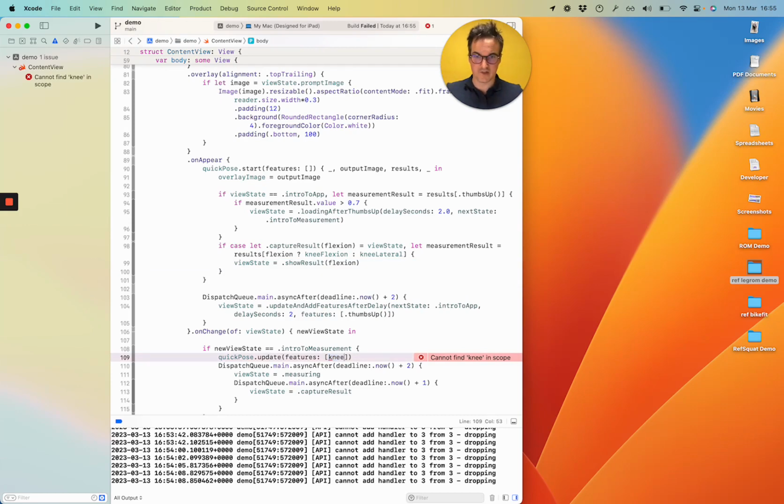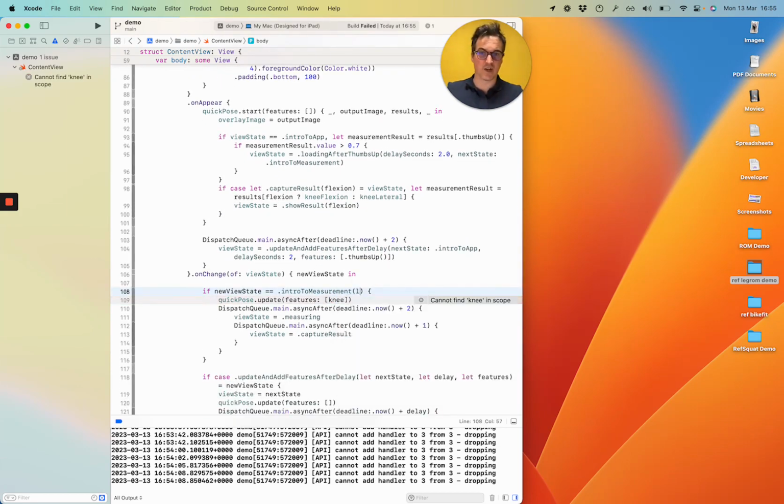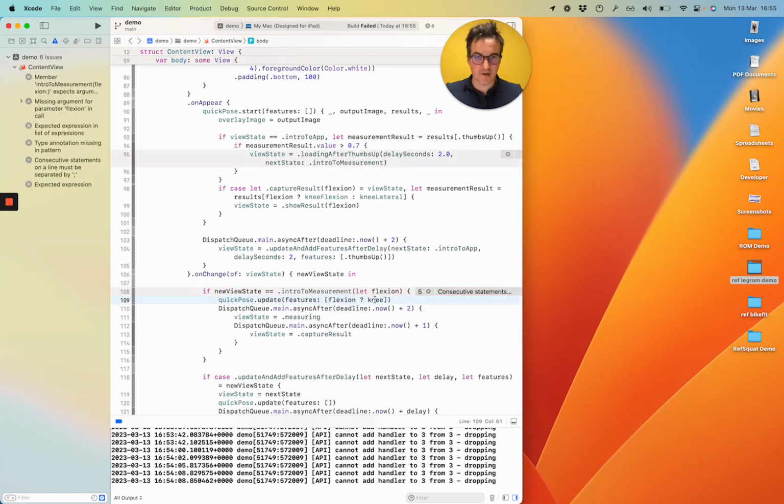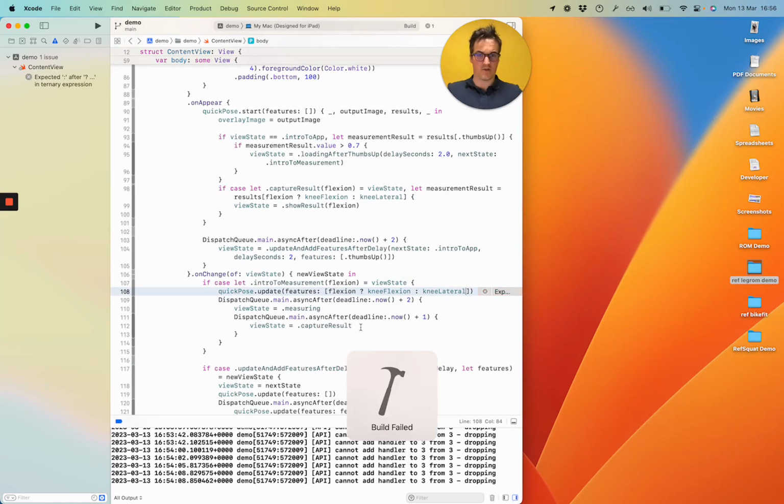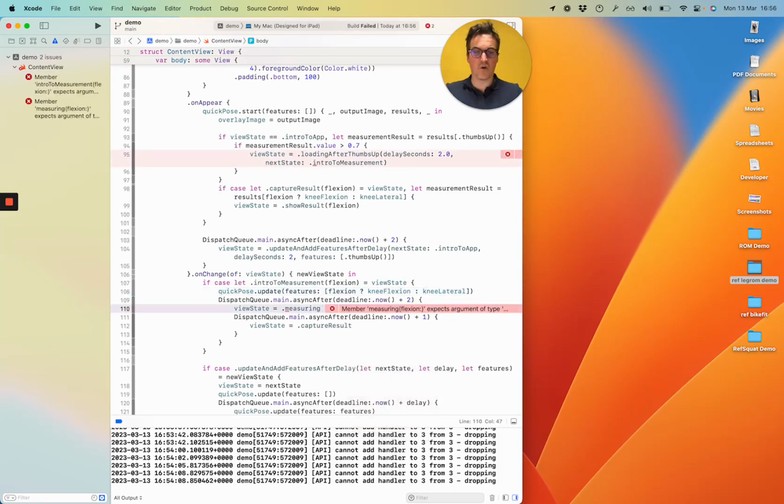Similarly down here, this needs updating. The intro to measurement needs to know if it's flexion or not. It's sort of just a big conditional change to any time a feature goes in, any time a feature goes out. Oh yes, so this enum check here requires the case let, so we can pull out the value. And this knee flexion, if it is true. Cool. All of these now just require flexion piping in and passing down the line.